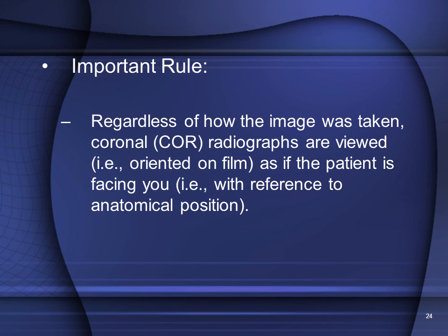So this is with reference to anatomical position. The film is always oriented, or the image is always placed on the film, with reference to anatomical position.